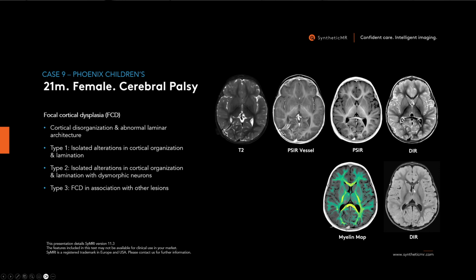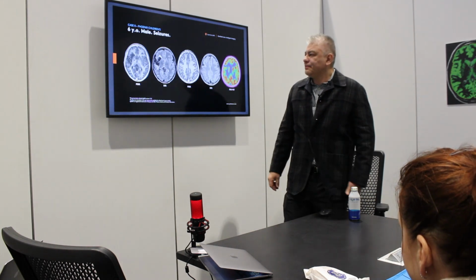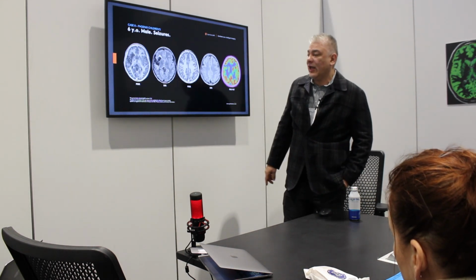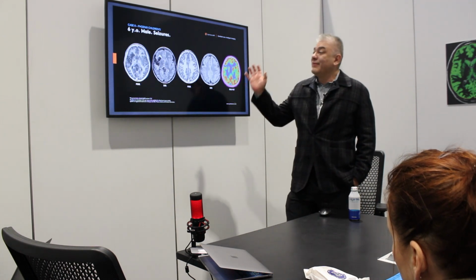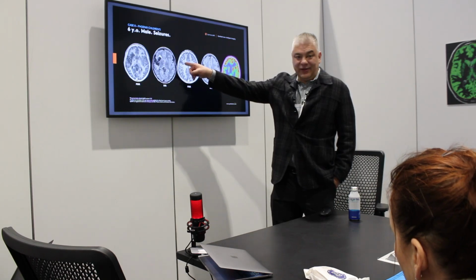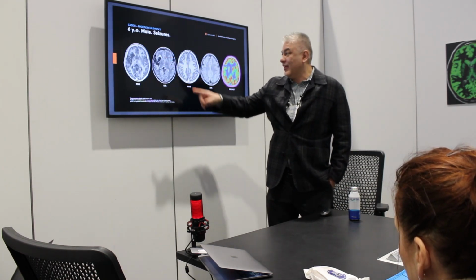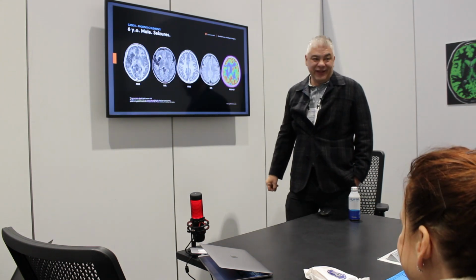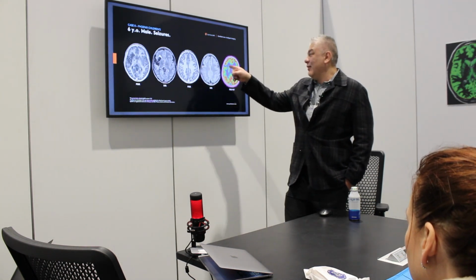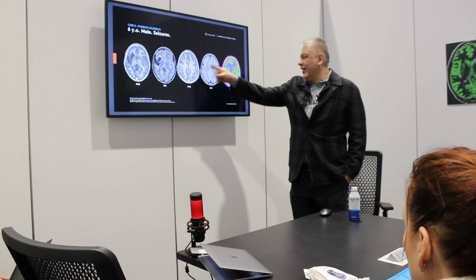Is it an intrauterine infarct? The patient had some type of vasculitis, so it was a postpartum infarct. Yeah, it was postpartum. Now he's 6 years old. But aside from the infarct, it also has something. So he's not seizing because of the infarct. He's seizing because he has cortical dysplasia. And actually we have the FDG PET correlation showing that area. It's firing.